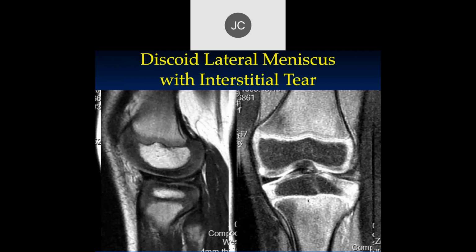Now, what commonly occurs with the discoid menisci is that they're traumatized because you have meniscus right in the weight-bearing area, and the meniscus is really not designed to handle the direct weight bearing. It's just on the periphery, usually, in the central primary part of the weight bearing, and we'll talk more about the biomechanics of this somewhere else in one of these talks. You have direct force through a contact between articular cartilage and articular cartilage. Around the periphery, you stabilize this and you increase the contact area by having the meniscus fill in the space, so that the overall contact surface is much enlarged, by over 50%, with the meniscus.